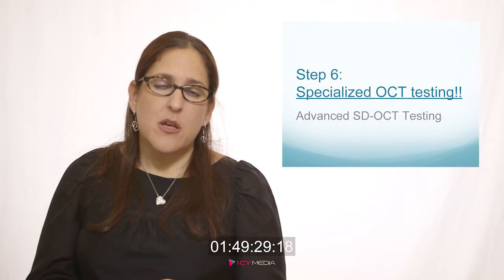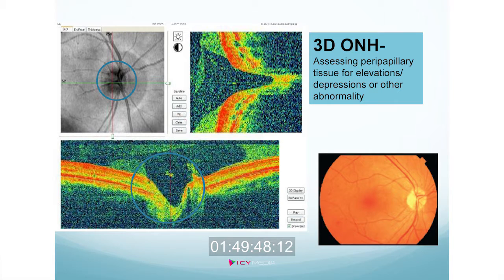Then we go ahead and we move forward with our specialized OCT testing. The screening exam did not give us any abnormal data, but we clearly know at this point that the patient has something abnormal going on. We know that the nerve is abnormal, and we know that the visual field was abnormal. So now we want to move forward with the exam and get more specialized testing. So we're going to start off with that 3D optic nerve head printout that we talked about when we started with the diabetes lecture. Okay, this gives us information about the peripapillary tissue.